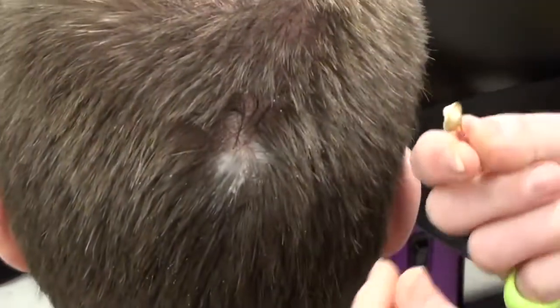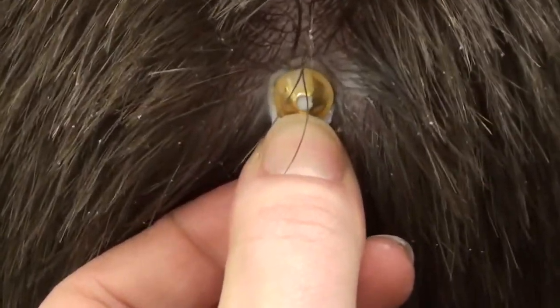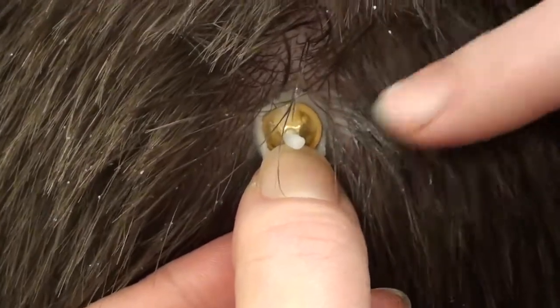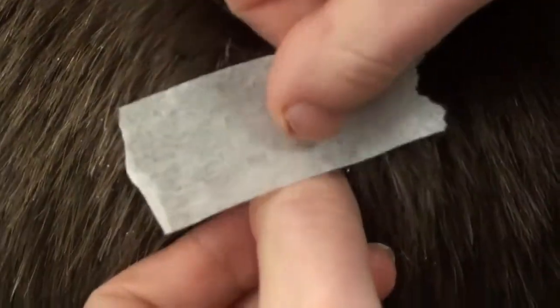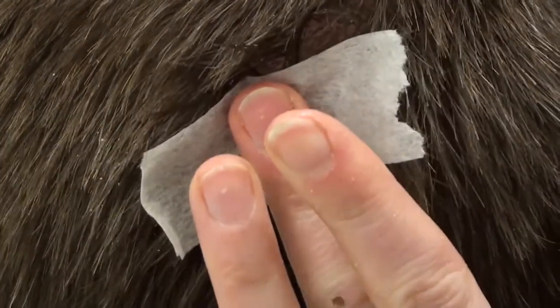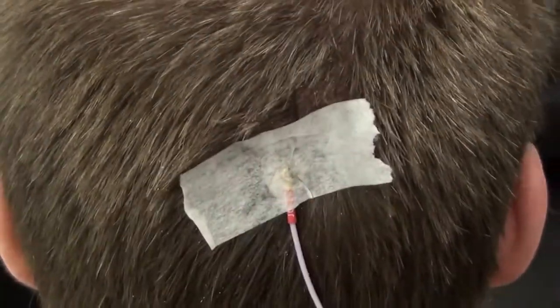Now we're ready to take the electrode and, same as before, press it down so that the conductive paste comes out the sides and the top. We use gentle tape and tape the electrode into place, applying gentle pressure as such.